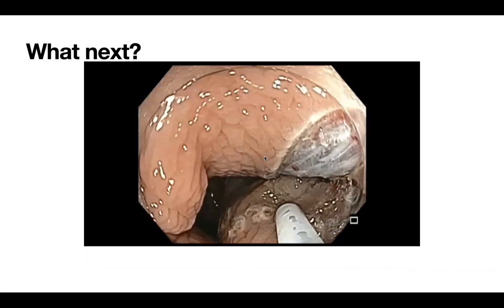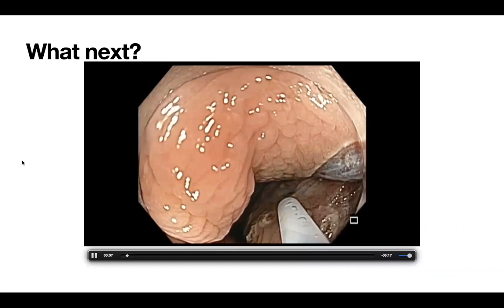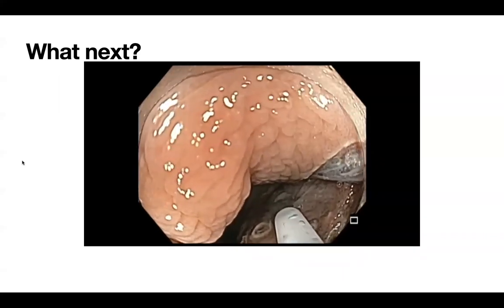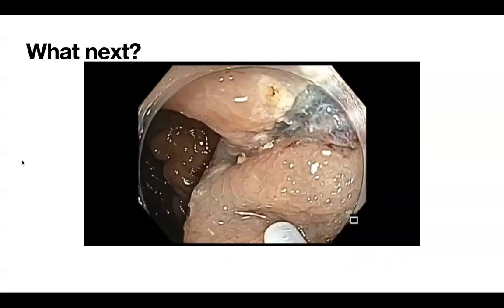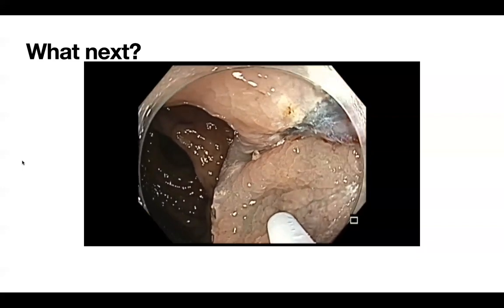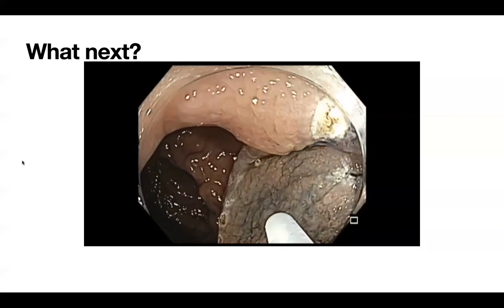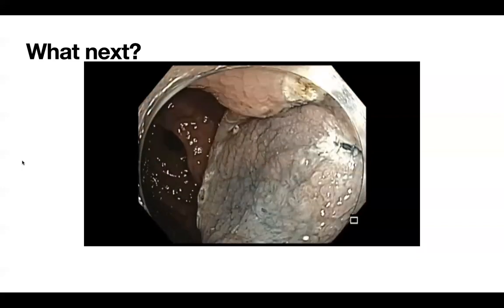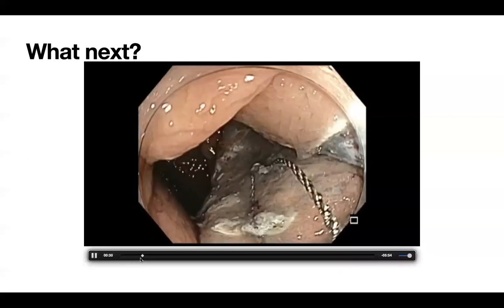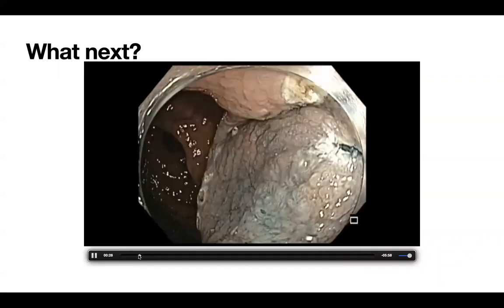So it's very interesting. You will see here, this is almost a long video, just bear with me. When I was cutting on the right side, it was pretty easy. It went smooth without much problems. But the left side cut became technically challenging, and you will see my struggles as I was going through this. Why don't I stop here for one second? I want to go back.